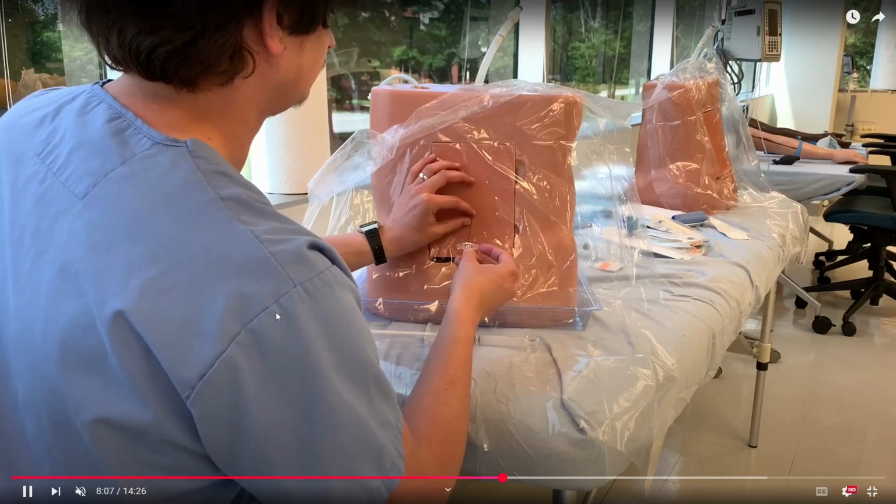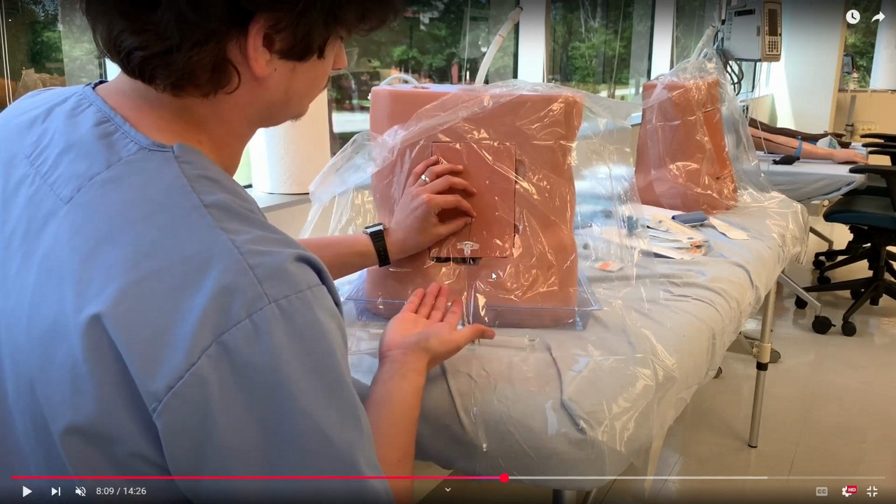And it's at this point in which you could insert the epidural catheter, give your test dose, and verify correct placement, and then go ahead and anesthetize the patient properly.